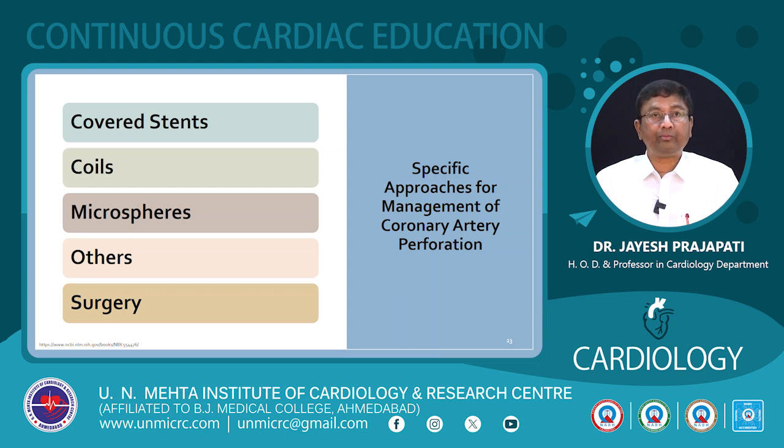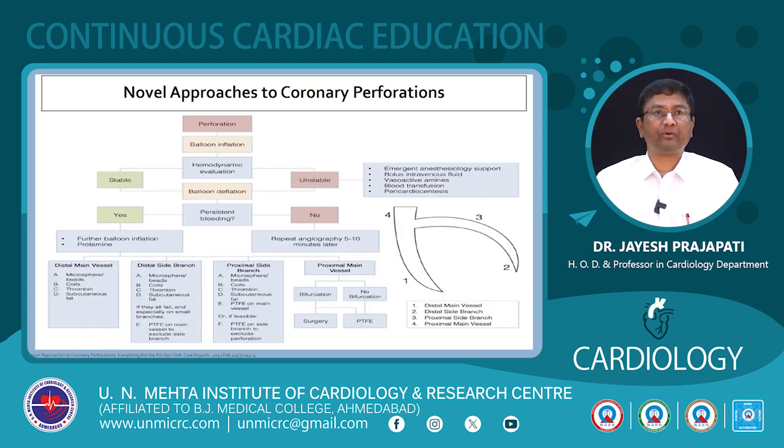While using a covered stent, you have to be very careful. You should specify the certain area where the perforation is. Sometimes you put a covered stent and there is still a leakage, so you have to post dilate it and make it proper, because optimization is most important in a covered stent. Sometimes you have to put a second covered stent also. Post dilatation is most important while using the covered stent. You have to seal it off properly. Sometimes with a very diffuse perforation the patient requires surgery also.